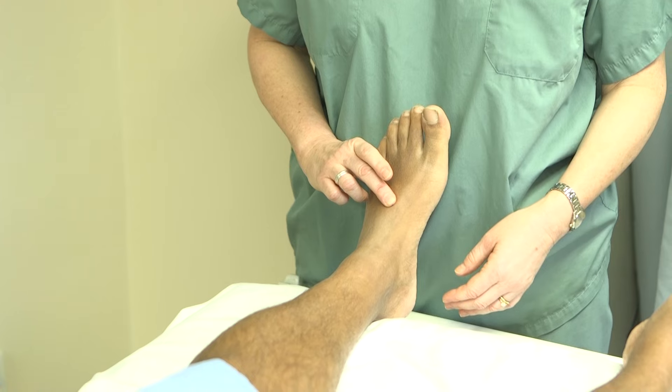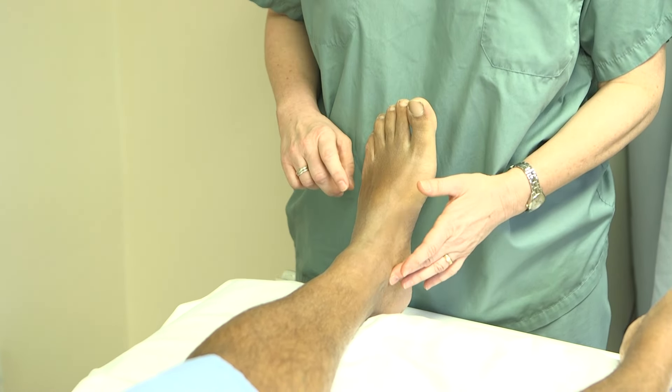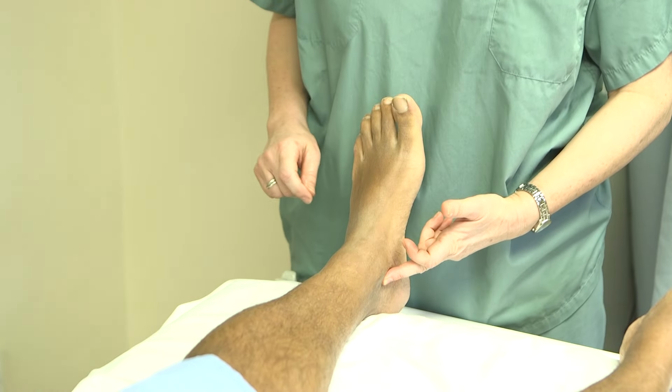I've located the dorsalis pedis pulse on the dorsum of the foot, and I can also feel the posterior tibial pulse, which is located just behind the medial malleolus.